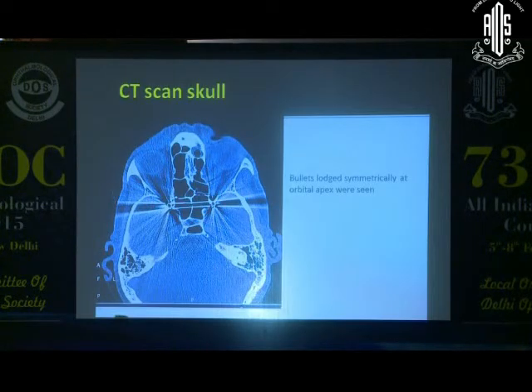A very, very unusual event to happen in an unfortunate patient. On the axial, the coronal and all the images, it was corresponding to the optic struts which separate the superior orbital fissure from the optic canal. So this is where they lodged. Yeah, that's very interesting. Actually, you will never see such a case in your lifetime probably again.